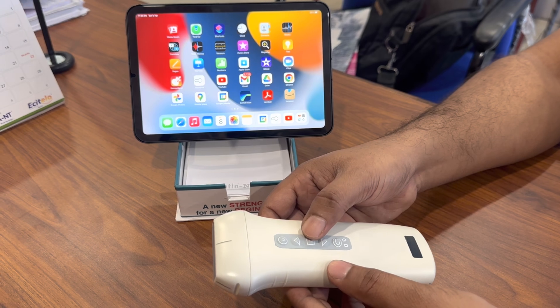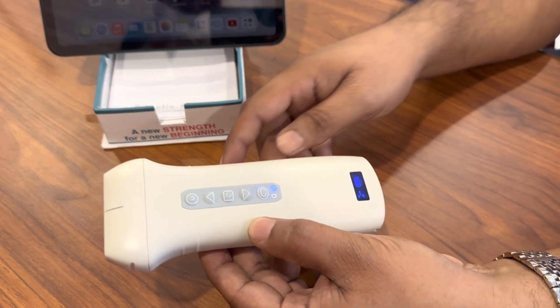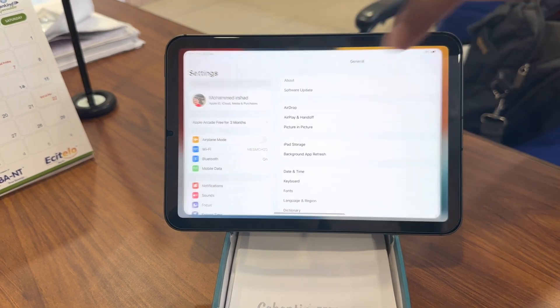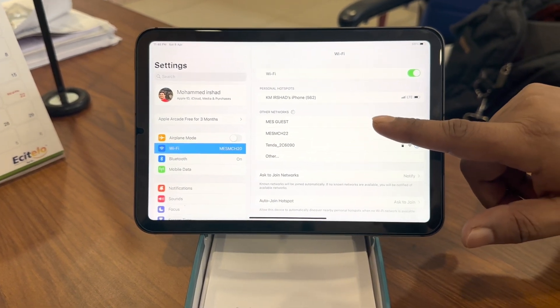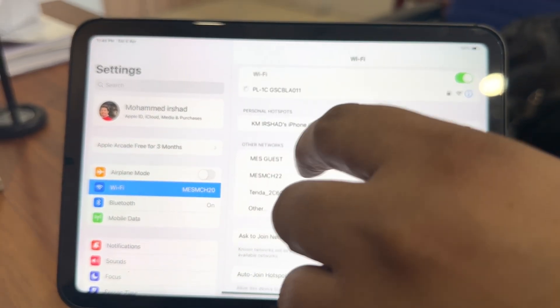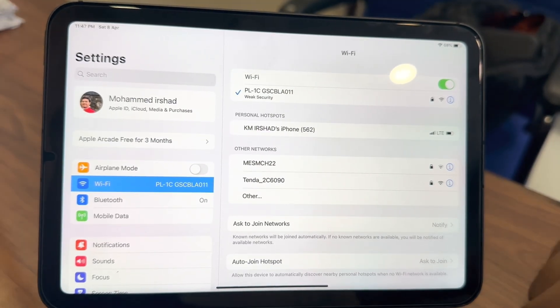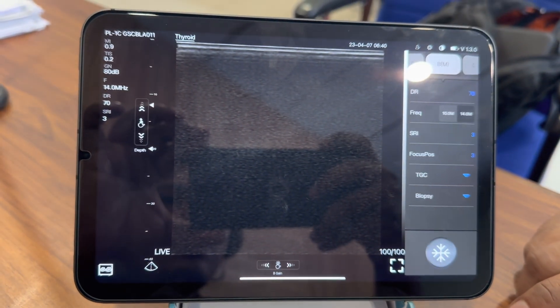To switch on the device, press the button in the middle of the device that powers the probe on, which is indicated by the blue light. Now we need to connect the probe with your mobile phone or tablet. Go to the settings, turn the Wi-Fi on, and you can see the device name in the Wi-Fi list. Press on the device name to connect the device to the iPad. Then open up the app where you can see the standard ultrasound screen.